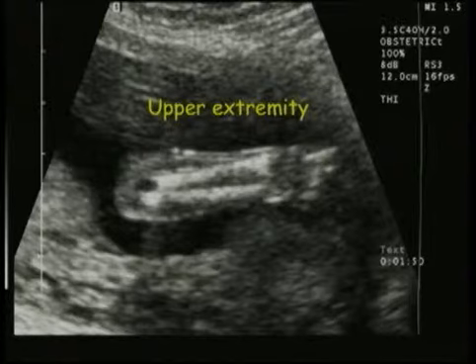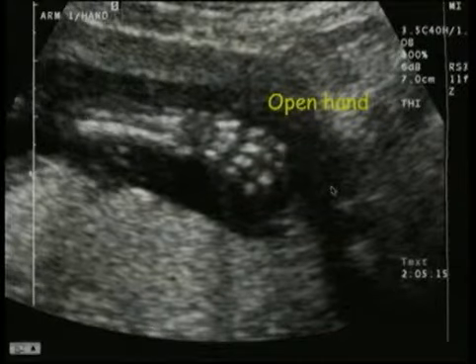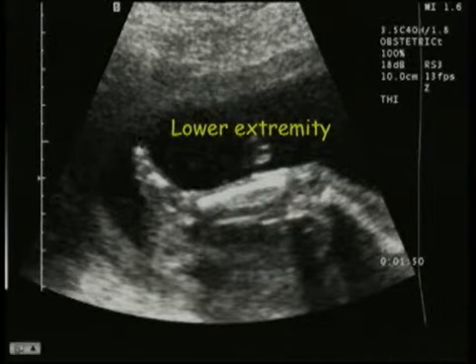The upper extremity, we're supposed to look at those extremities, so we take a picture showing the humerus and the radius and ulna with the hand below. And we don't take open hands on everyone, but we do try to in some patients who are at increased risk. The lower extremity, we take pictures of the lower leg and of the ankle.